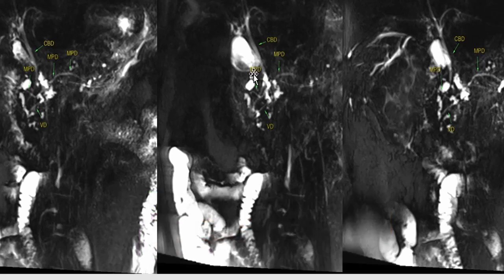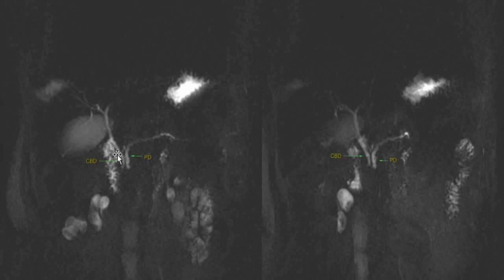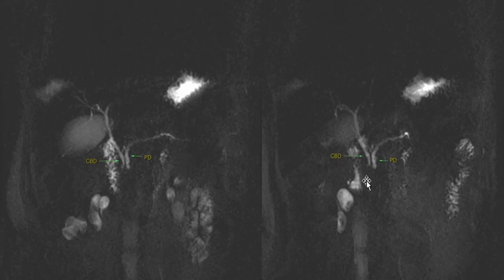These multiple hyperintense areas are likely necrotic areas in the pancreatic parenchyma. Thick slab MRCP images in this patient show a dilated main pancreatic duct. The CBD is prominent with abrupt cutoff of the terminal CBD. The confluence of CBD and main pancreatic duct is not visualized — this is the so-called double duct sign. This patient had a lesion involving the uncinate process of the pancreas.